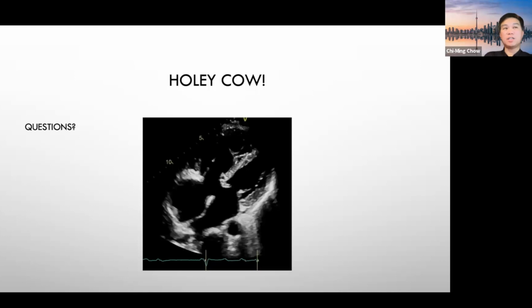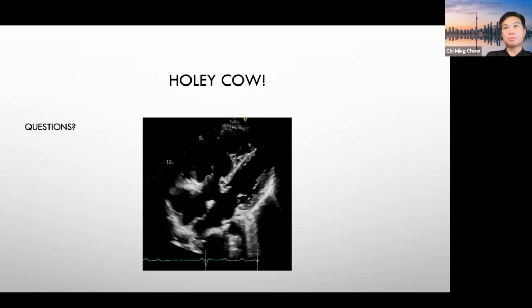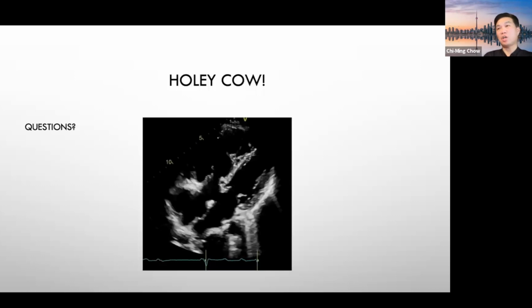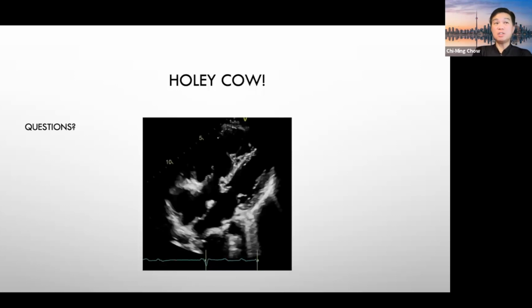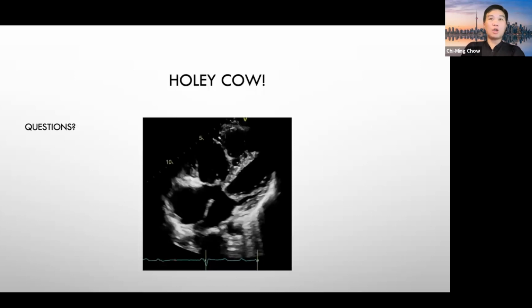Yeah, having a high index of suspicion is very important. I think we do have a protocol established for that reason. That's why we put color on all the different parts that we do, to look for small holes or high velocity flow that may not be apparent with a defect on the echo sometimes. So any abnormal flow, you have to follow it.